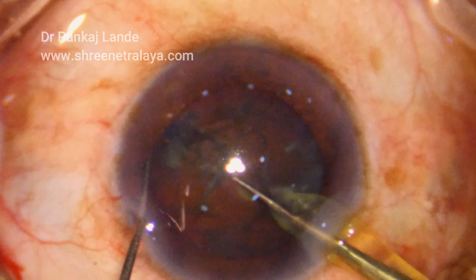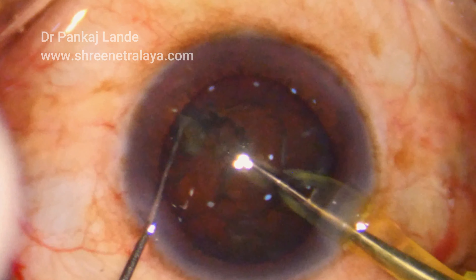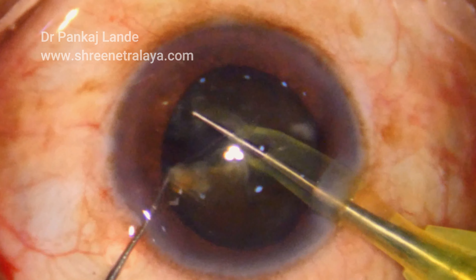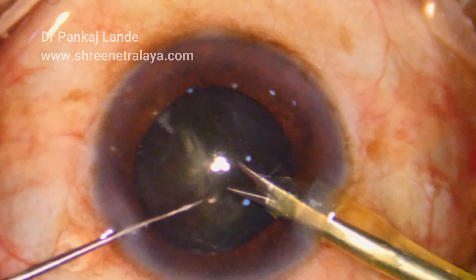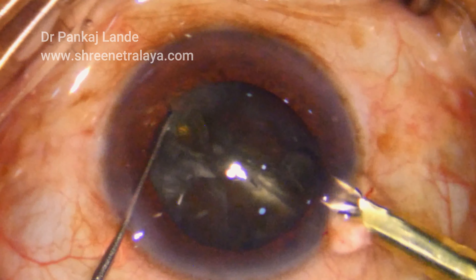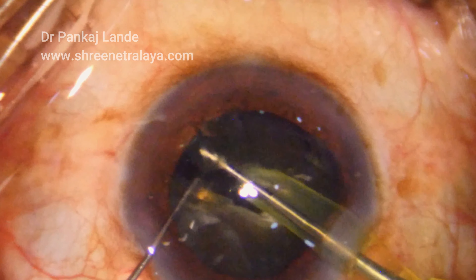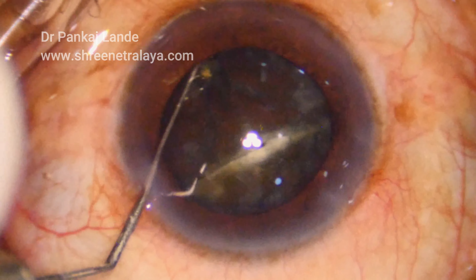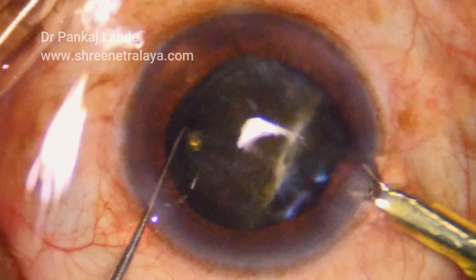I have supported the nuclei with my left hand, embedded it, and then ultrasonic energy is utilized. See how beautifully and nicely it has cut through a very hard nuclei. Completing the first cleavage chop — I was reforming the anterior chamber in between, as this was only the second case I was using this tip.